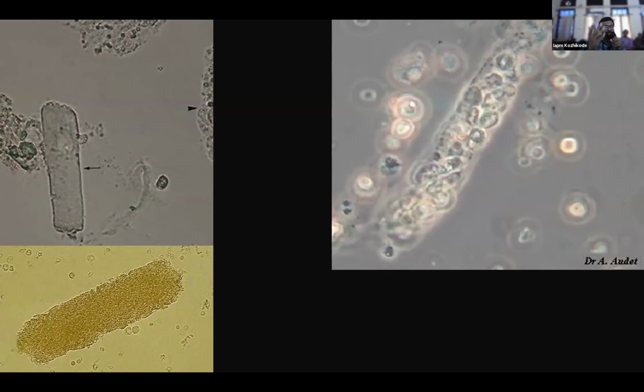This is not in peak. Okay, when I am having an SLE case with a lot of cellular casts, then I certainly know that this is having disease activity going on. And suppose I am seeing a renal biopsy and I am seeing only a few glomeruli, say the class 5 pattern, and I am seeing cellular casts, I should think again and again before signing out the report, because it is highly likely that I will be going wrong.